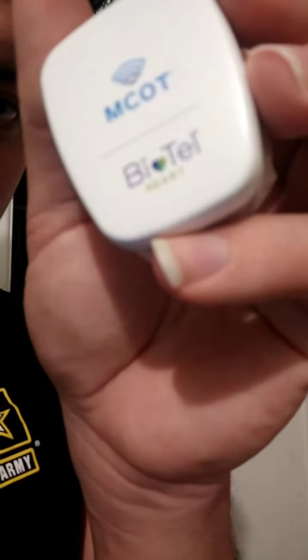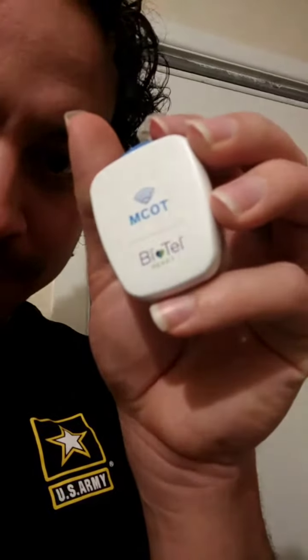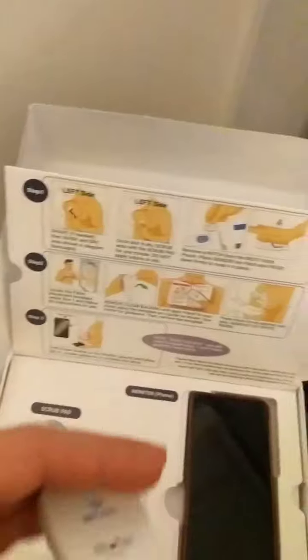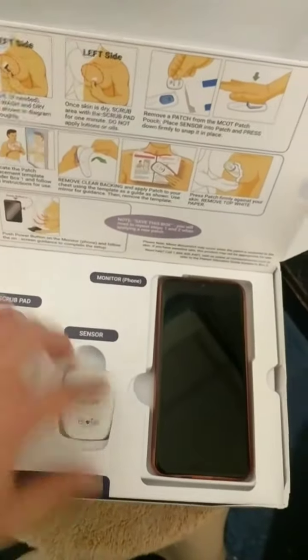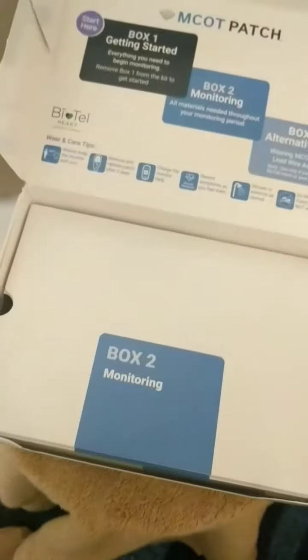Pouch. Look at the lights up. And pull this out. I'm going to patch it. And then this goes back in there. And then there's the charger and the other stuff.